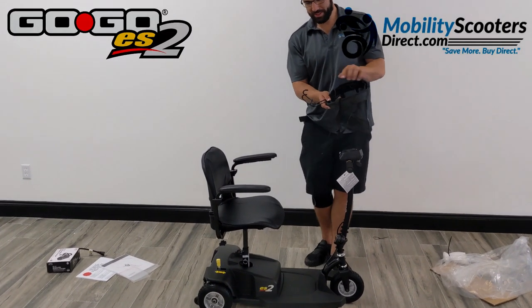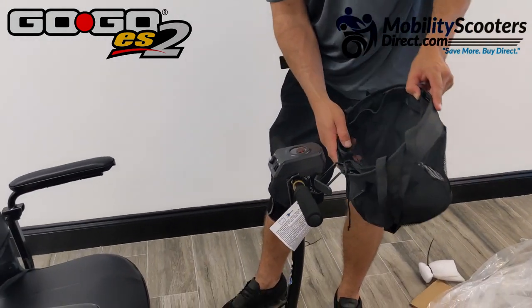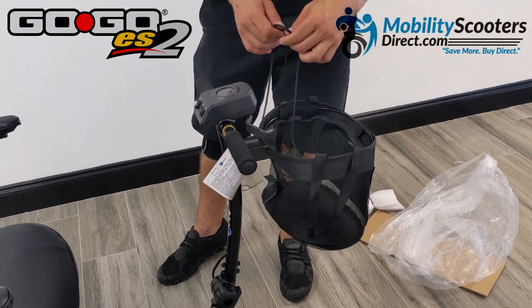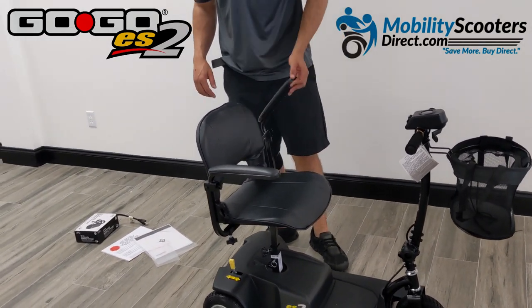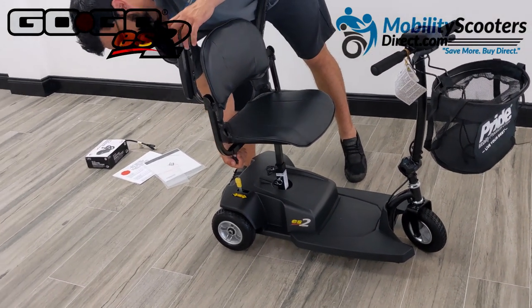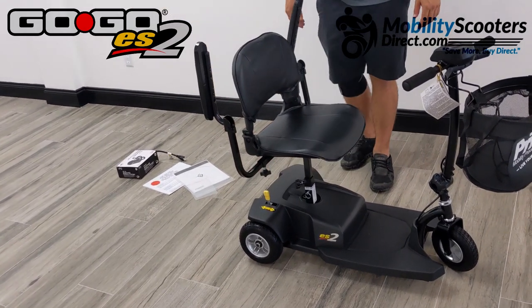To connect the basket, bring the hooks underneath and tilt forward. There is a little drawstring so you can tighten up the fabric mesh in the basket to secure your belongings. The armrests do flip up and are width-adjustable with those tension adjustment knobs — you can slide the armrests in and out to make your ride more comfortable for your body type.